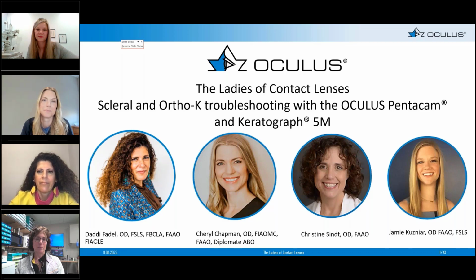We're all very excited to have an all-women's case review panel tonight. I would first like to introduce Dr. Daddi Fadel. Dr. Fadel is a clinical scientist at the Center of Ocular Research and Education. She is internationally recognized as a KOL and actively lectures in 5 languages. Dr. Fadel is a pioneer of modern lens design and a specialist in contact lenses for irregular corneas, scleral lenses, myopia control, and orthokeratology.